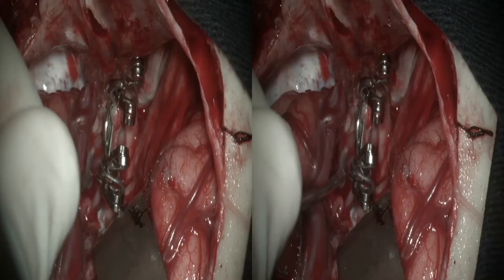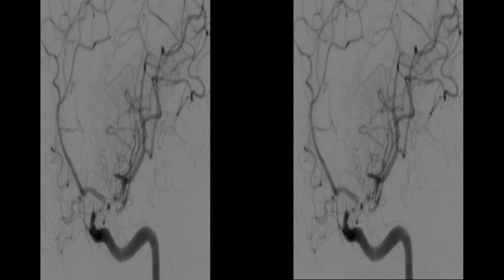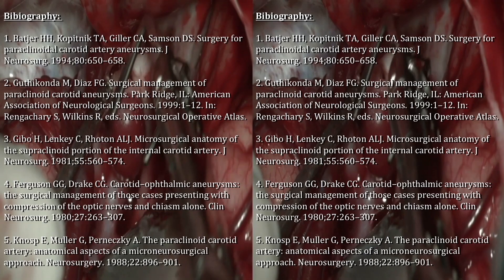The final surgical view is observed. Postoperative angiography shows complete exclusion of the aneurysm, and the patient shows no neurological deficit. The patient gave her consent to publish her images.